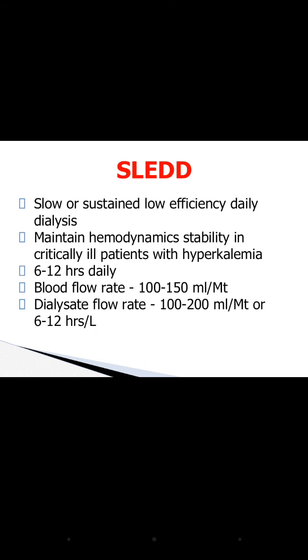Now SLEDD, we can write it as SLED also or SLEDD also. So it is slow or sustained low efficiency daily dialysis, or slow or sustained low efficiency dialysis. So basically it is performed in critically ill patients who are having hyperkalemia also. It is not like the CRRT, and it is basically in between the intermittent hemodialysis and the CRRT. So it is in the middle of that.